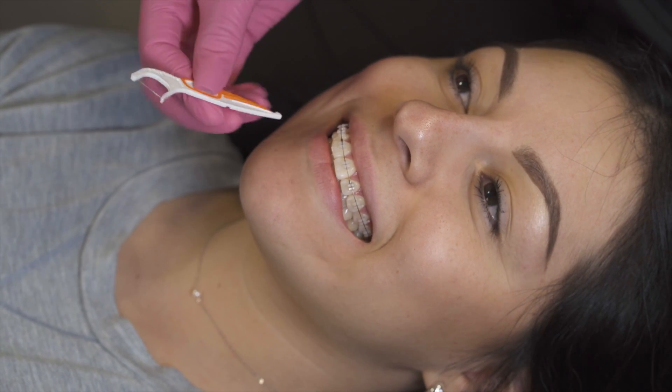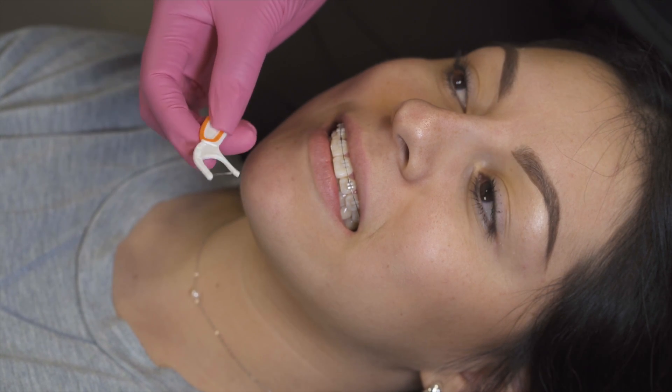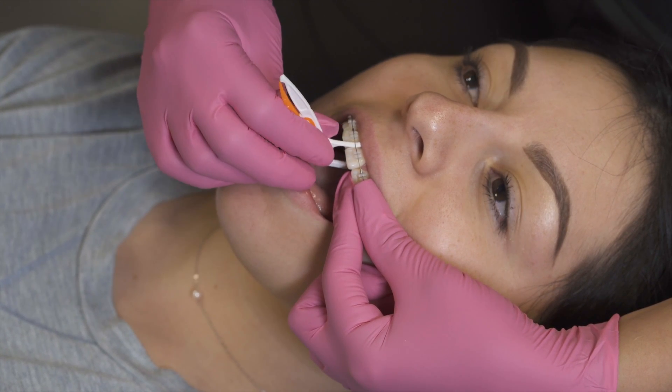So I'm going to show you two ways to floss. First I'm going to start off with the ortho pick. This is a really easy way to use. The only thing you need to do is slide right underneath the wire, push up, and then slide back.